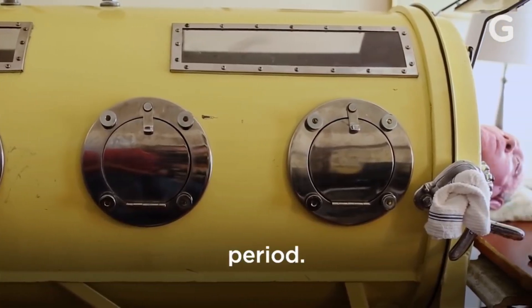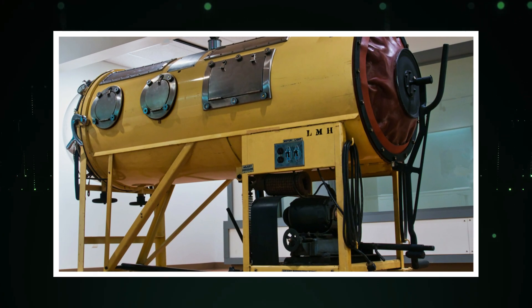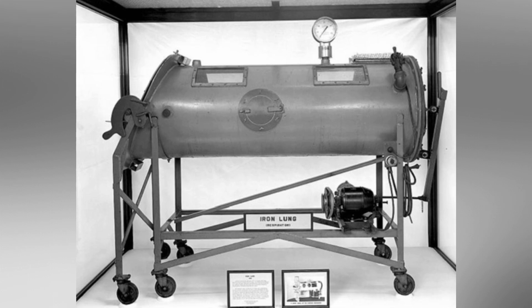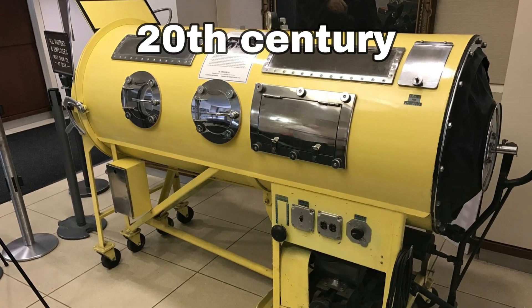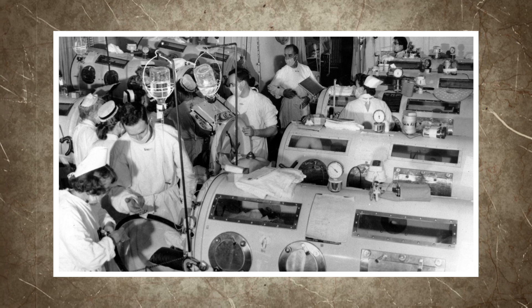When you think of medical devices, iron lungs might not be the first thing to come to mind. However, the history of iron lungs is a fascinating and important one, filled with innovation, perseverance, and hope. From the earliest prototypes to the sophisticated models of the mid-20th century, iron lungs revolutionized respiratory treatment and saved countless lives during the polio epidemics of the past.